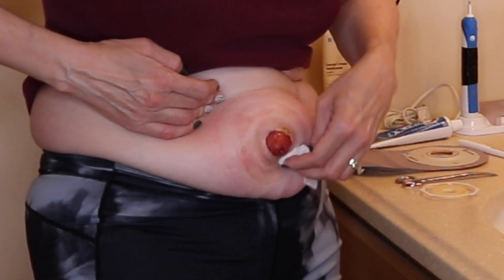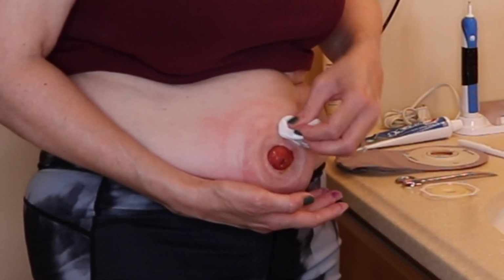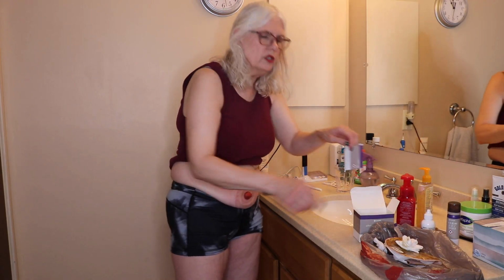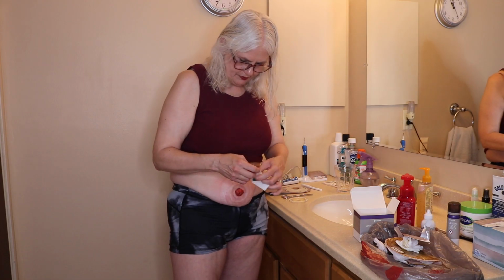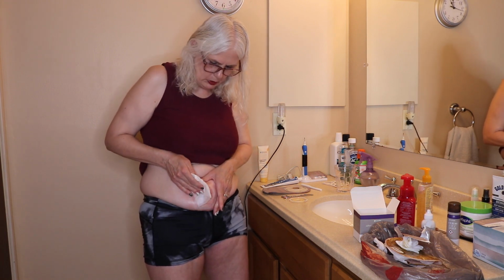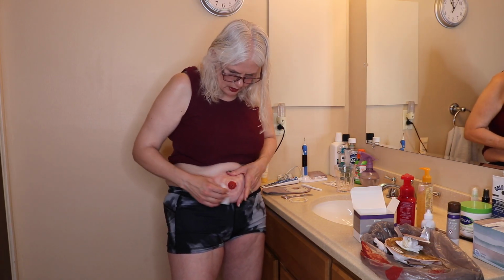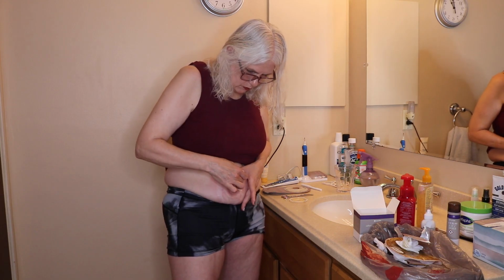This barrier ring residue is kind of like a glue dot, if you know what that is. It's very sticky. So if it does get on the floor and all that, it could also be kind of hard to clean up. I usually stand over my bag and I wipe everything up so that everything will fall into the bag if it needs to. Sometimes when you get credit cards in the mail, or if you're old enough to get those AARP cards, or even fake credit cards saying, hey, sign up, they use those glue dots to glue the cards onto the paper. That's what this is like. It's very sticky, which is good. It needs to hold everything in place.